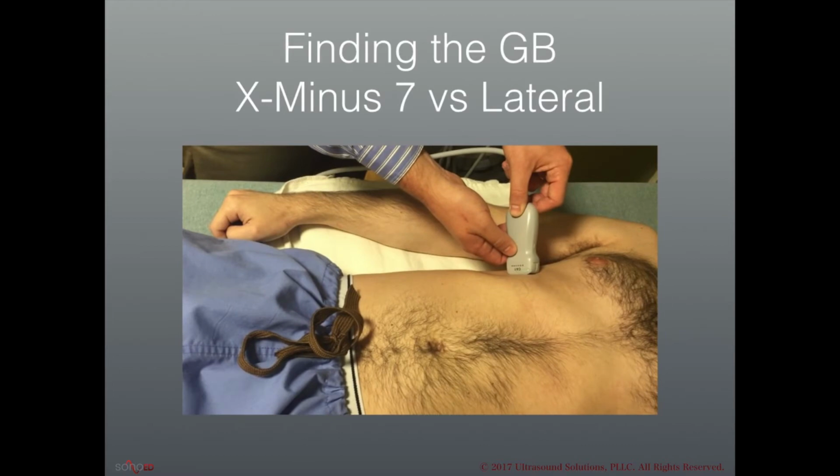This technique is the one I use most frequently. However, it does take a little bit more finesse because you have to navigate the ribs and the artifact that they'll create on the screen.